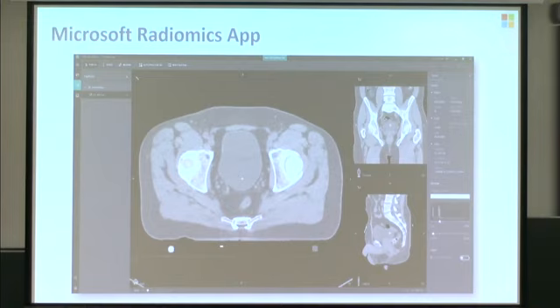So we developed an application working in conjunction with the InnerEye team to implement machine learning using the kind of cross-sectional imaging that we use for radiation therapy. The original project we did was focused on glioblastoma, using lots of different MR imaging sequences, using all the data that we had available, which was really cool, and we got some interesting stuff. But here we had to go to ground roots and say, well, look, most radiotherapy planning is just done on unenhanced CT. Can we build solutions that work for this?